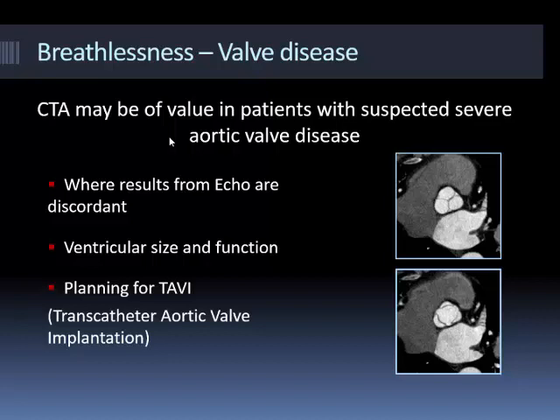One of the things that you'll hear in the TAVI lecture as well is we've sometimes combined CT with echo in cases where the echocardiographer is not sure is this moderate or is this severe stenosis, just by looking at the extent of calcification.